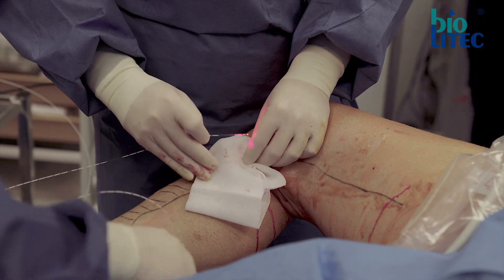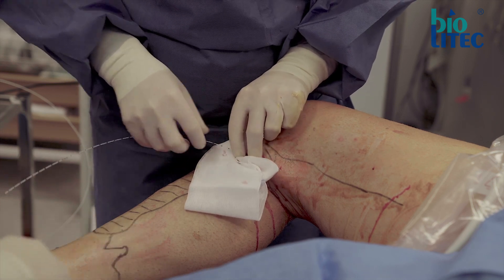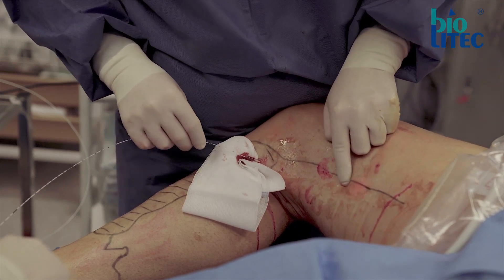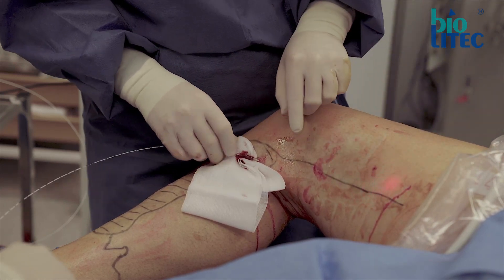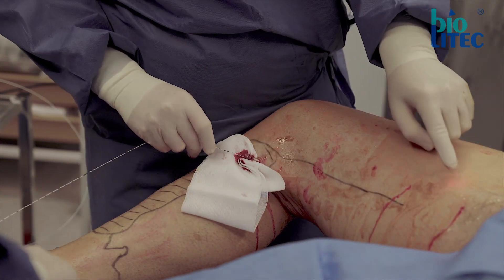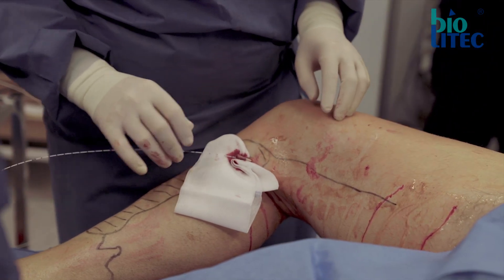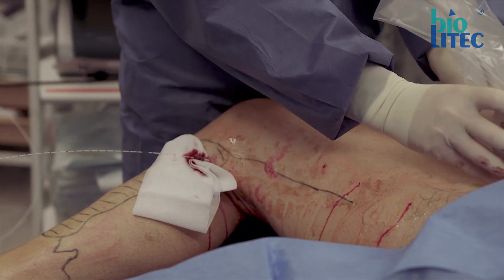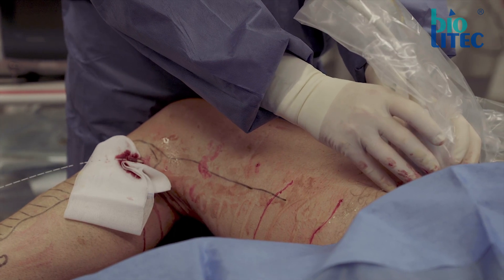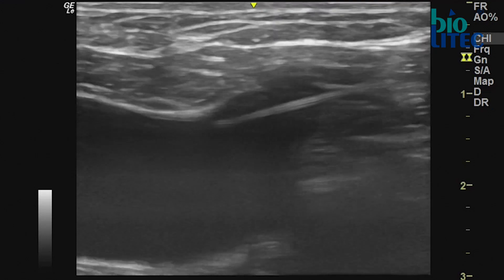Advancing the catheter is in general very easy. If necessary, some external compression can be applied or the leg can be extended to facilitate this. Following the pilot beam can be helpful to locate the fiber tip. I prefer advancing the catheter slightly up into the common femoral vein and then pulling it back slowly until the right position is reached. As the action happens perpendicular to the catheter, it is possible to stay fairly close to the saphenofemoral junction without risk of harming the deep vein.